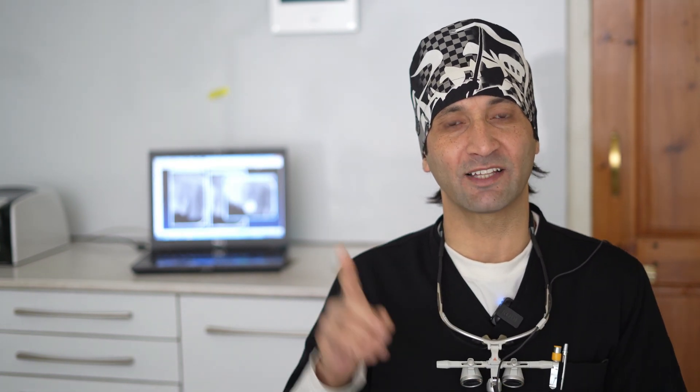These are not the usual symptoms after root canal treatment if it is done correctly. The patient came to me and told me all the complaints. I performed clinical and radiographic examinations. The important finding was that the crown was placed right at the gum margins, the gingival margin, and the luting cement used to fix the crown was still there and not cleaned properly. The tooth was slightly tender on percussion and the crown was not placed on the tooth properly — the procedure was not done professionally.